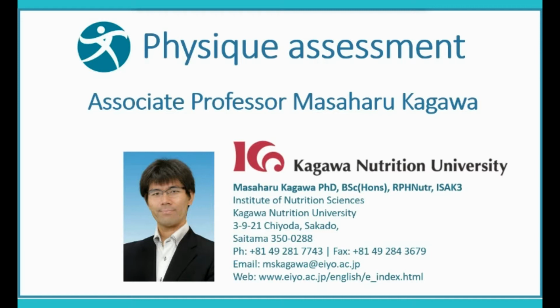Associate Professor Masaharu Kagawa. Ultrasound is useful to visualize subcutaneous fat tissue compared to the general skin fold technique, which is a compressed layer of subcutaneous tissue. It is a single layer of subcutaneous tissue. Therefore, the participants may find it easy to understand what they have been measured.